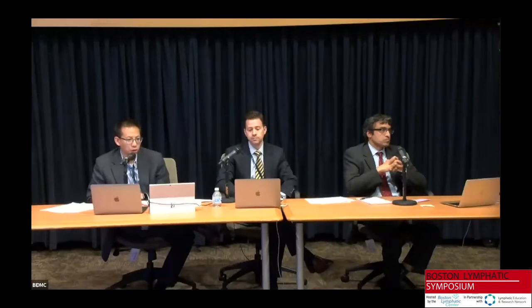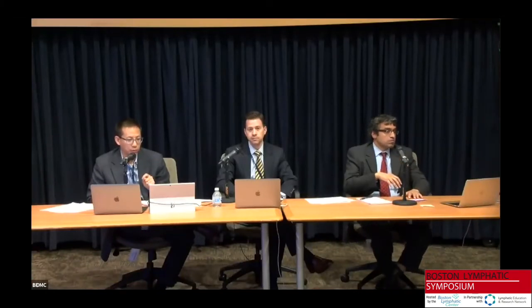Aki, I just have a quick question for you. How important is it? Because with 18 megahertz, it's very difficult to see any valves. Do you feel that seeing the valves with a 70 megahertz is an indication of the lymphatics having a better function? Since we're talking about function, this has been a question in my mind. And you're talking about the valves of the lymphatics, right? That's correct. Valves of the lymphatics.